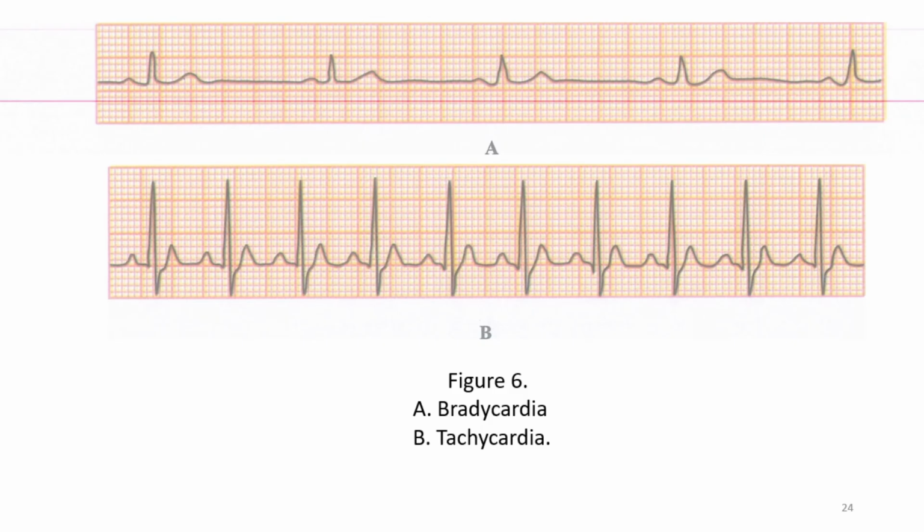You see here a bradycardic electrocardiogram, and then a tachycardic electrocardiogram. As you see here, if it is, let's say, 2 large squares, then 300 divided by 2, here 150 times heart is beating. And then if we look at here, 1, 2, 3, 4, 5, around, so if we divide 300 by 5, it is 60 times per minute.